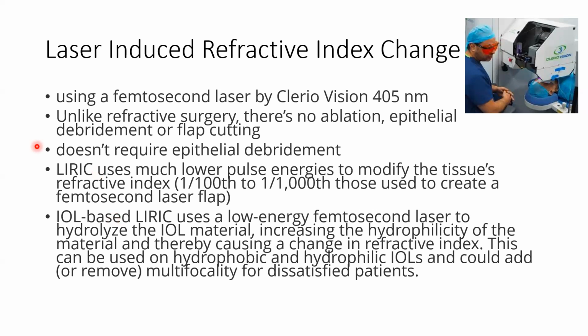flap. Another application of LIRIC is that it can be used to modify IOLs as well. It uses a low energy femtosecond laser to hydrolyze the IOL material and change its refractive index.